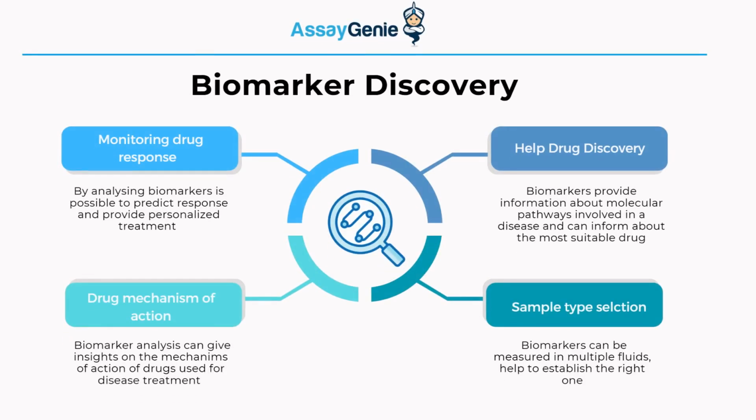Biomarkers provide crucial information about molecular pathways in diseases. They help identify the most suitable drugs, determine the best sample type, and gain insight into drug mechanisms of action. With the right biomarkers, drug discovery and treatment optimization become much more effective.